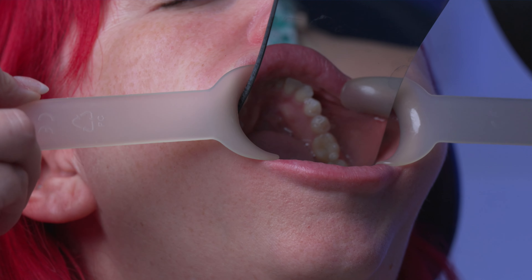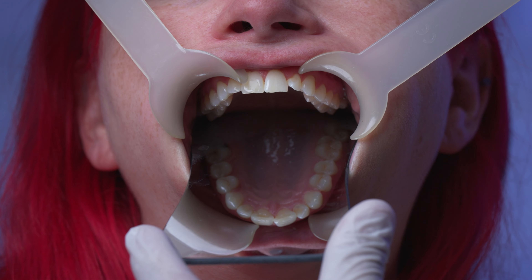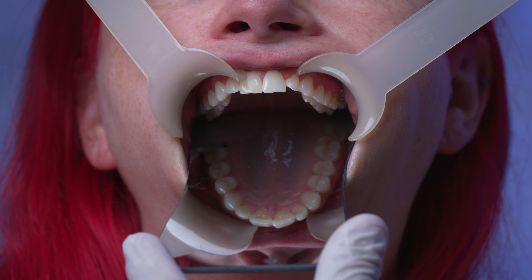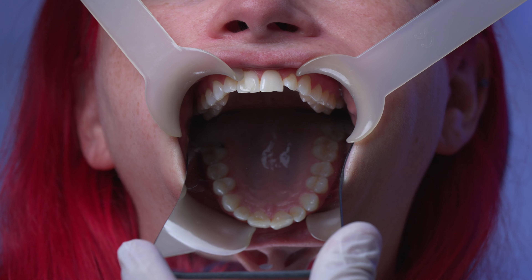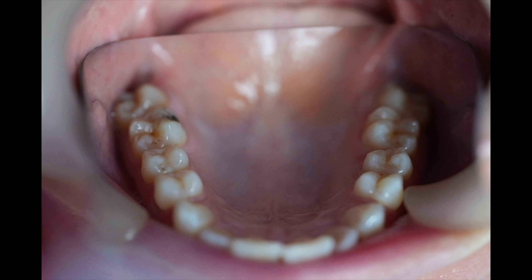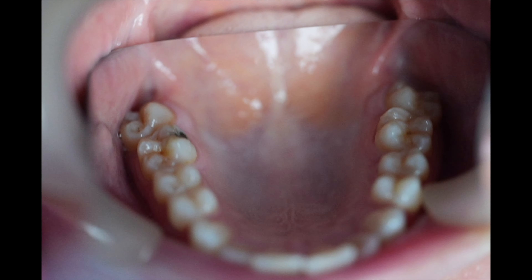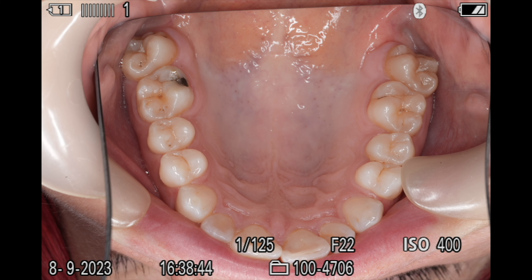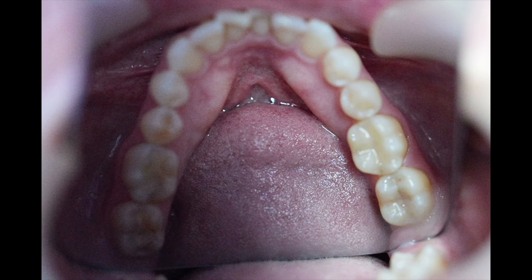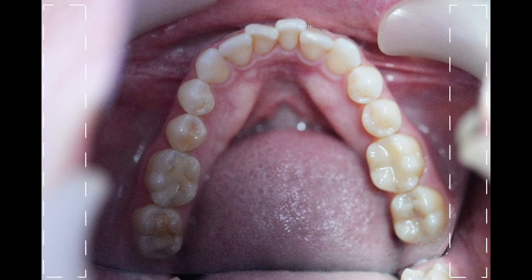For the mirror shots, you are aiming to have the full occlusal surface parallel to the camera plane. You will need to continuously ask the patient to open wide — even with the most experienced patients, everyone tends to slowly close their mouth during the process, so it's always worth reminding them to continually open wide. If you can see too much of the anterior surface of the teeth, the patient will need to open further. To ensure the image is straight on the upper arch views, you can use the median raphe for alignment. The lower arch is more difficult as it does not have any reference points; however, if you ensure equilateral space at the edge of the posterior teeth, it should be rotated correctly.